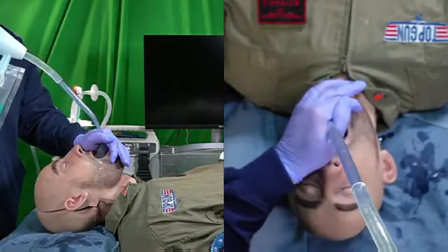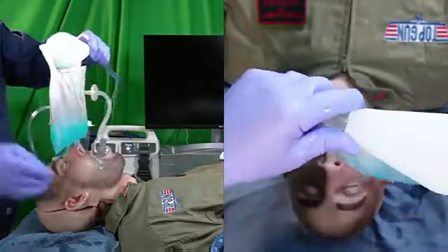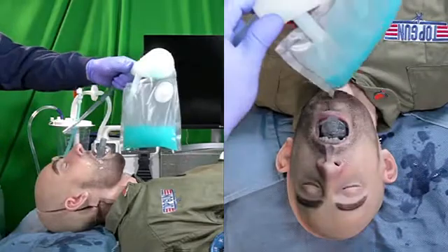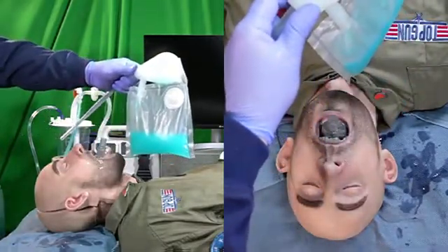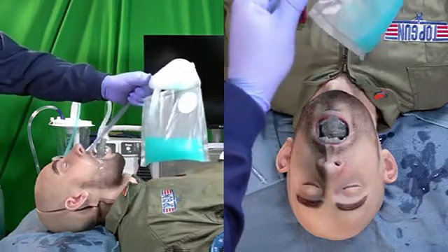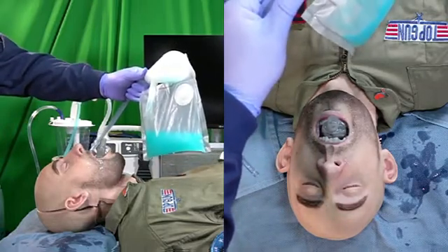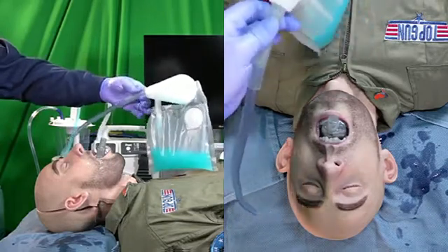I'm able to thoroughly decontaminate. So I have probably about 150 milliliters of airway contaminant here. What's important to note is that many of these portable devices hold much less than the capability of this device. This device is capable of holding 1,000 milliliters of airway contaminant. It's also capable of aspirating large particles.